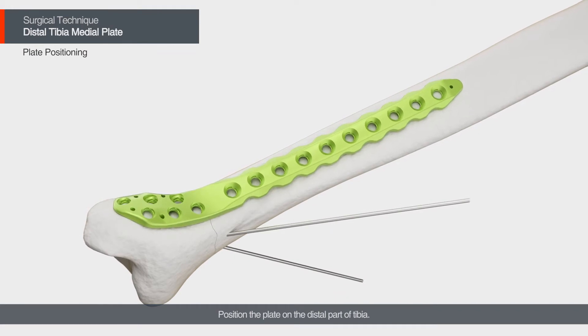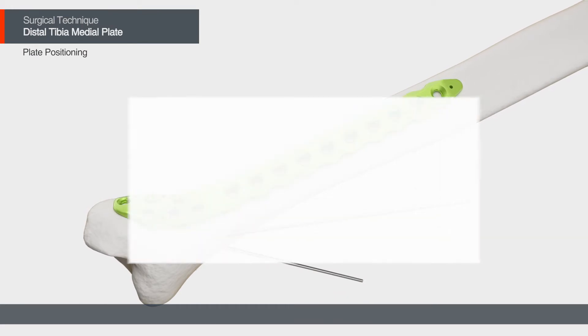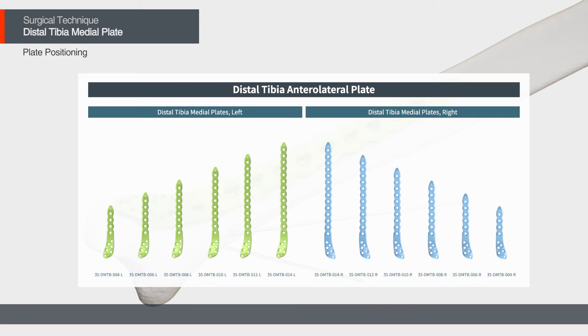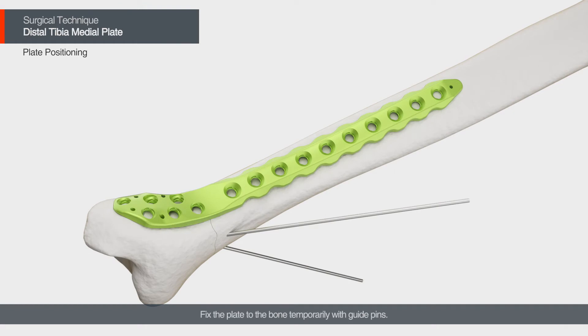Position the plate on the distal part of the tibia. Fix the plate to the bone temporarily with guide pins.